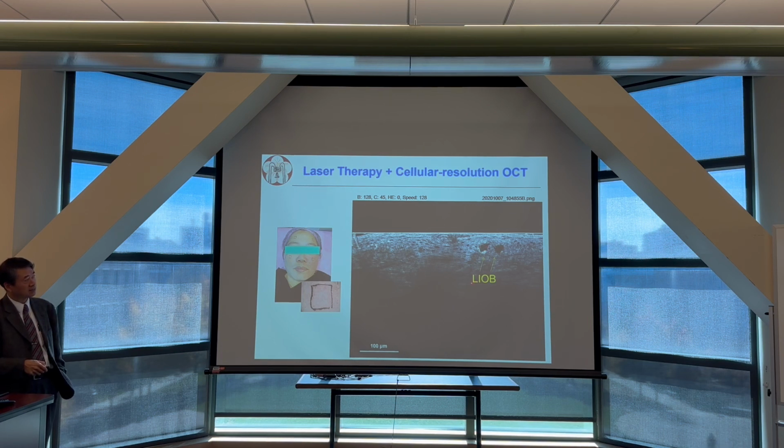We call this laser-induced optical breakdown. Without the OCT, you have no idea what's the depth of these holes, because it depends on the wavelength you use. The depth of this hole is different, and depending on the power you use, the size of this breakdown is different. So with the OCT, you can identify what's the best wavelength, what's the best optimized optical power to generate this kind of laser-induced breakdown.